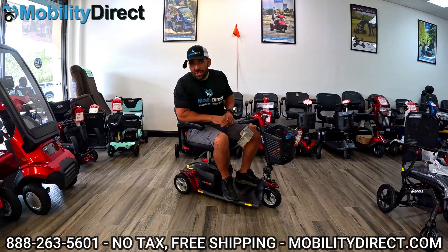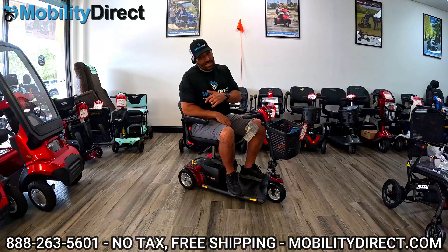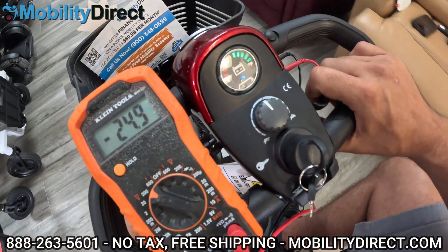Hey everybody, it's me, Sergio, with Mobility Direct. Welcome back to another tutorial. In this video, I'm going to teach you how to test the batteries on your GoGo Mobility Scooter.